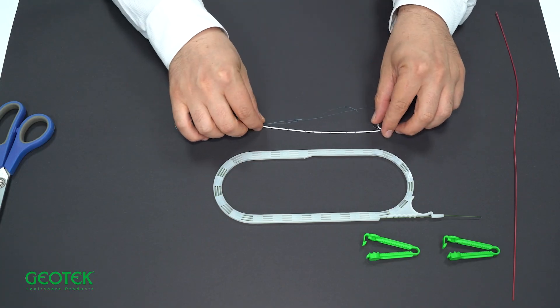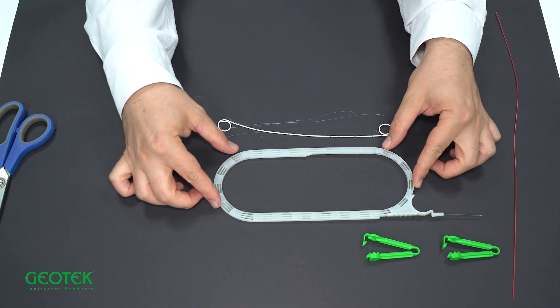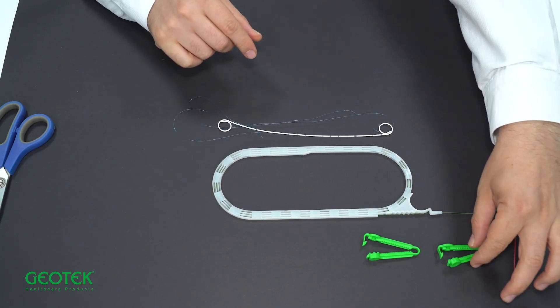When you open the package, there will be one double J stent, one guide wire, two compression clips, and one pusher.